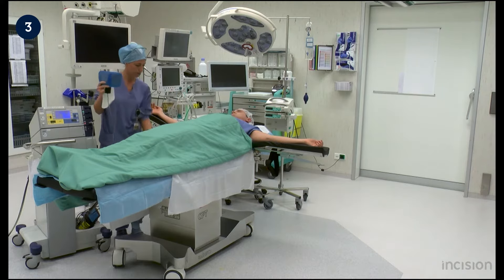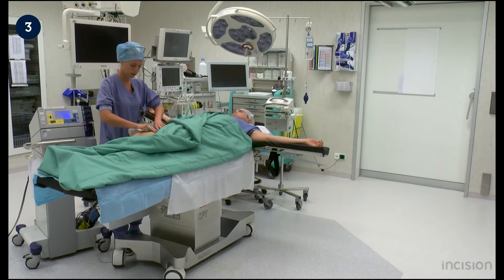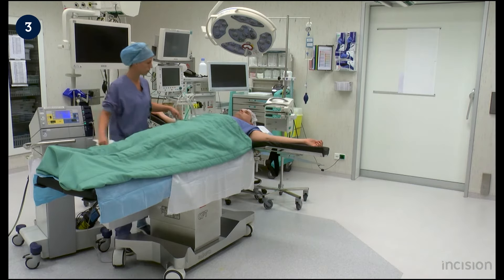When prosthetic materials are present, place the pad on the contralateral side or on the back of the patient.